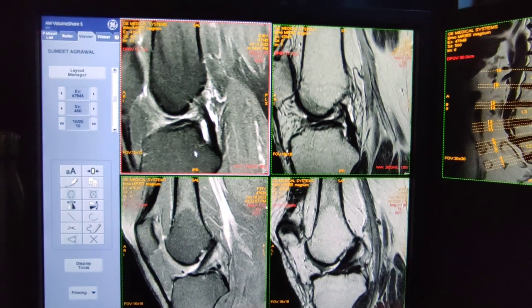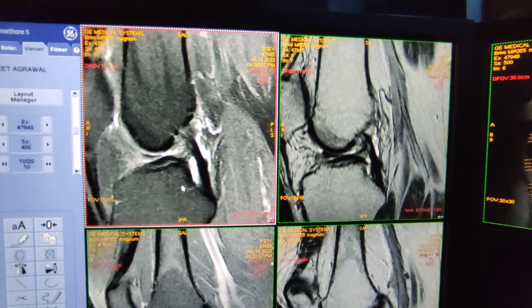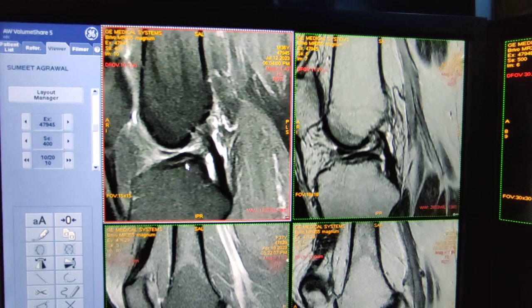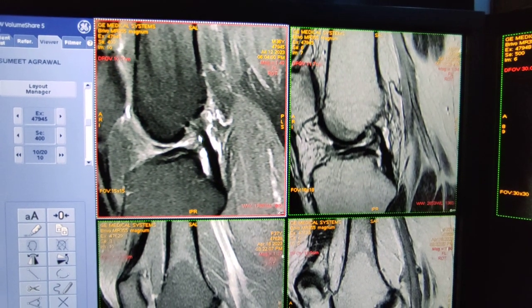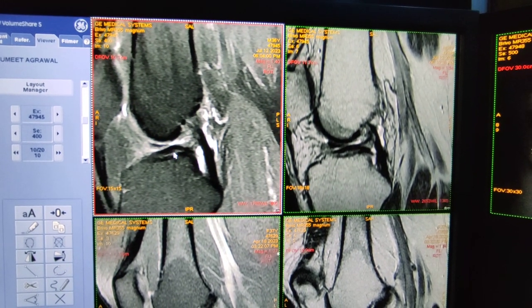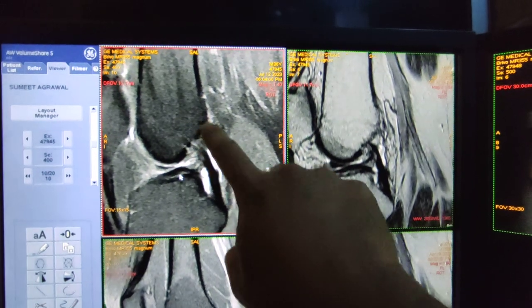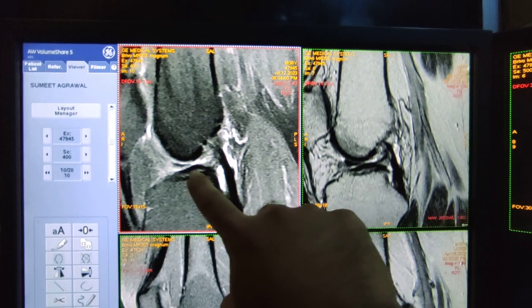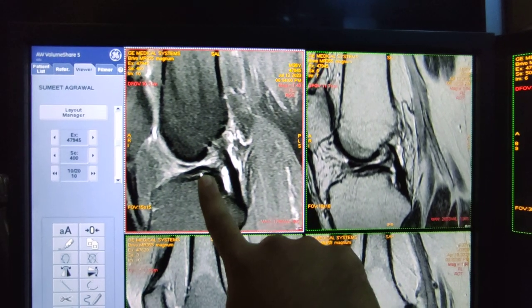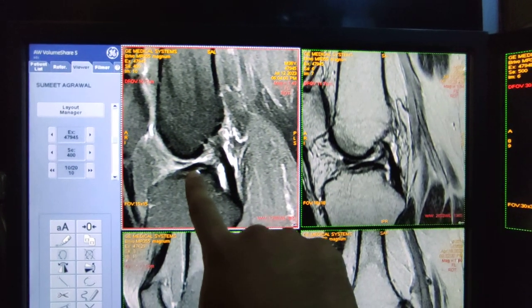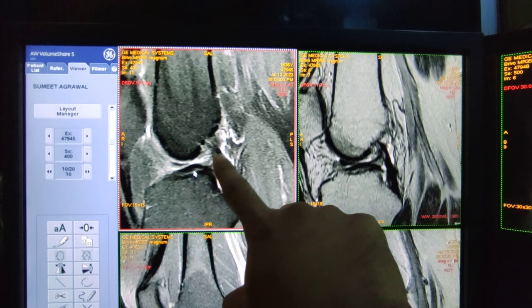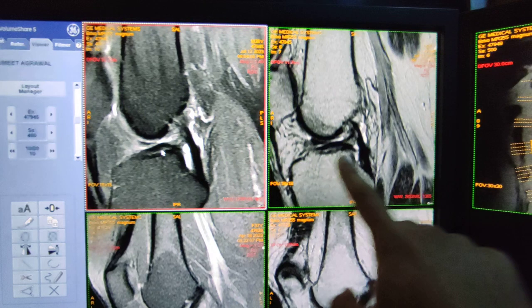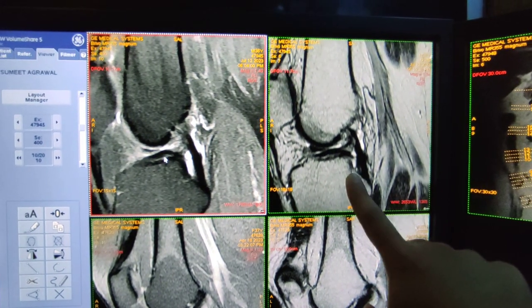Now I will show you a complete tear of the ACL. In this sequence you can see there is discontinuity of the ACL at the femoral attachment — this upper bone — there is no attachment of ACL here. This is drooping of the ACL. You can see this portion is the ACL, so in this case we can say it's a complete tear.